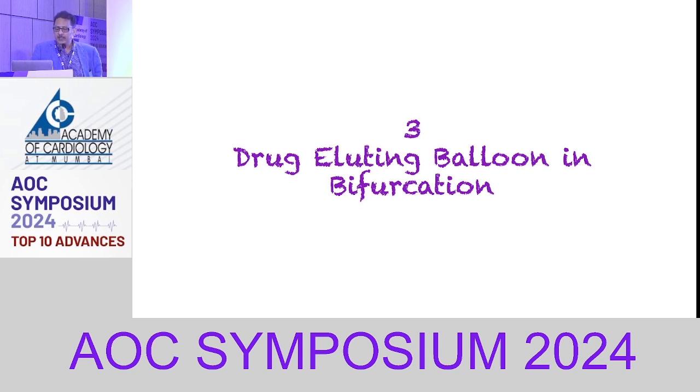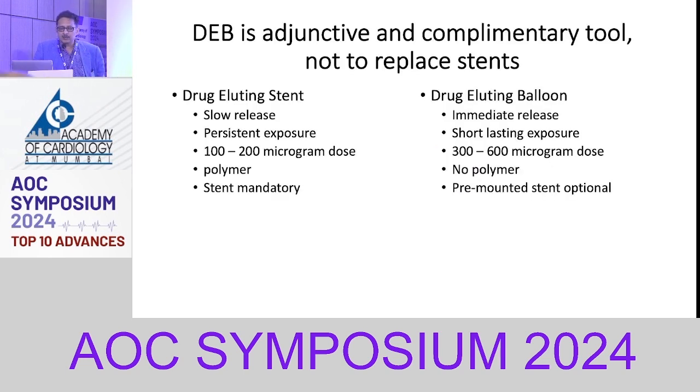The original balloons were Elutax, which we used in a fair number of patients, but those balloons are very difficult to track. So now there is a newfound, I would say, love for drug-coated balloons, especially in Europe, and the operator who is advocating this is Dr. Antonio Colombo. Principally, a drug-coated balloon is without a stent and a polymer, versus a polymer drug-eluting stent.